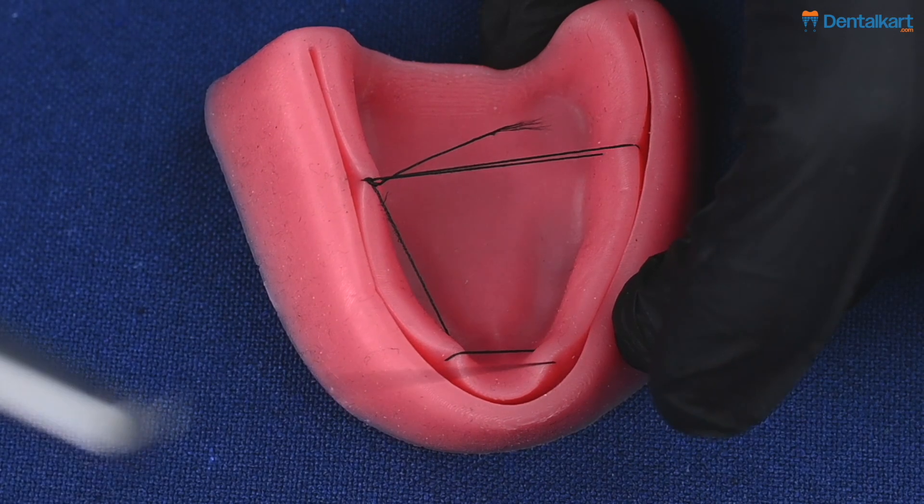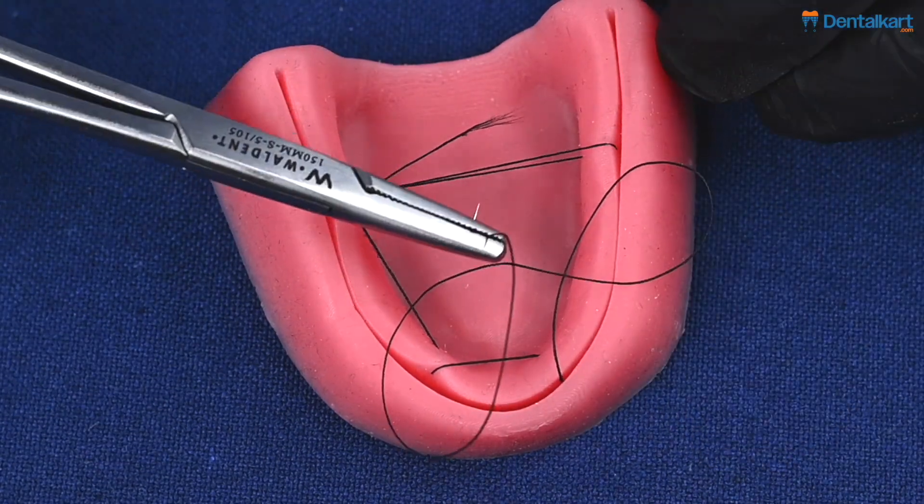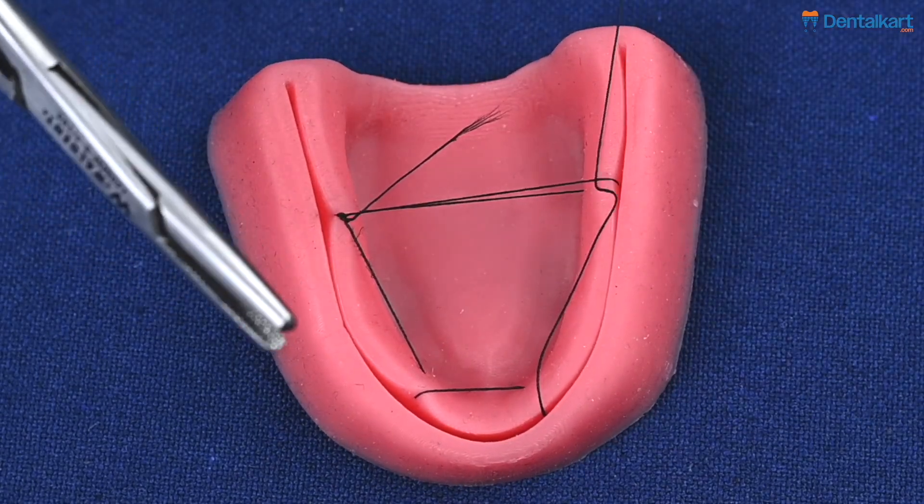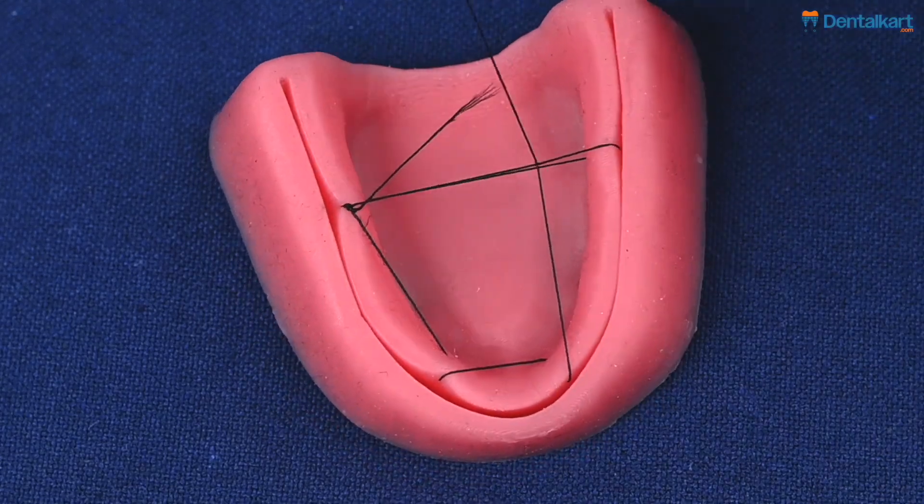Once we have done that, we pass the needle in between the two threads that had earlier been tied for the molar area, and we tie the final knot.